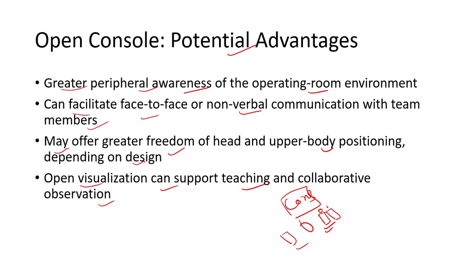They just have to wear 3D glasses, and they can see the operating field in 3D. That is the biggest advantage of the open console. It is not possible in a closed console, because there is only one viewer, which helps only the operating surgeon.